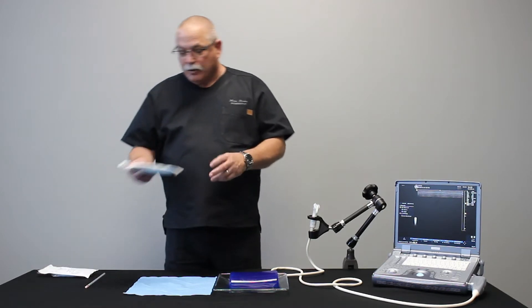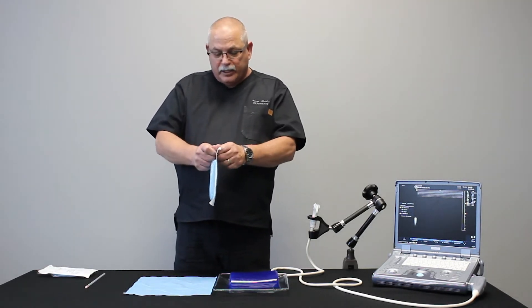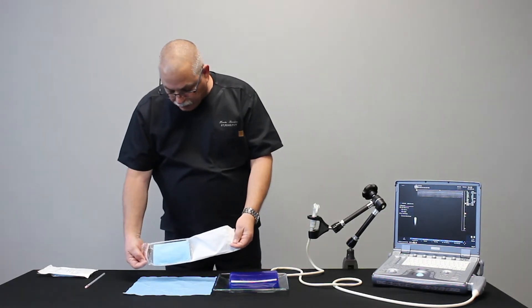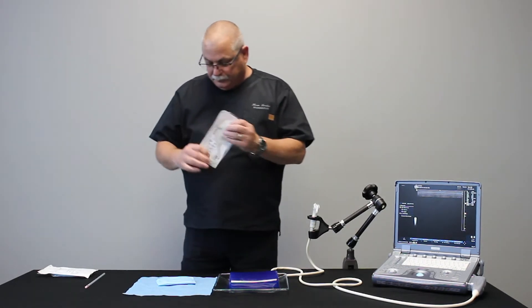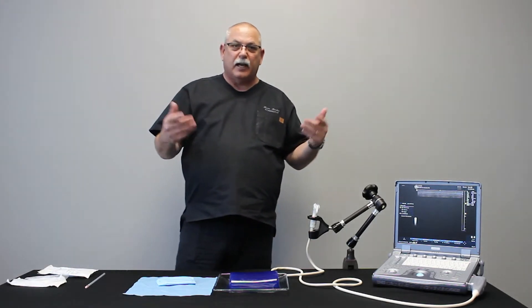For today I'm going to use the 12 to 18 gauge. I'm going to open the procedure packet and drop it onto my sterile field. Now I'm going to put sterile gloves on and we'll continue.